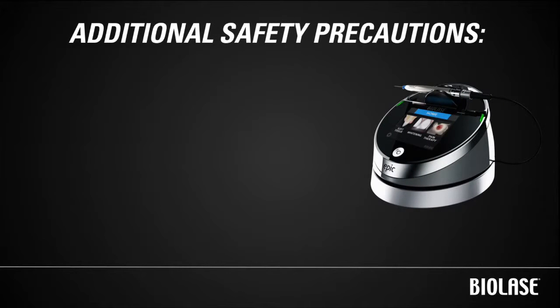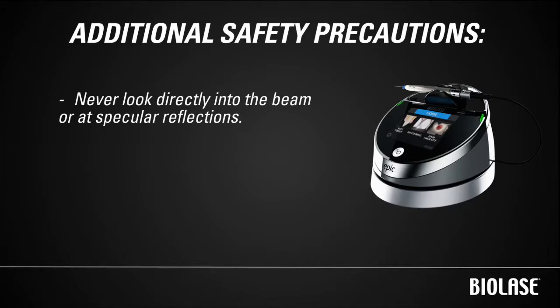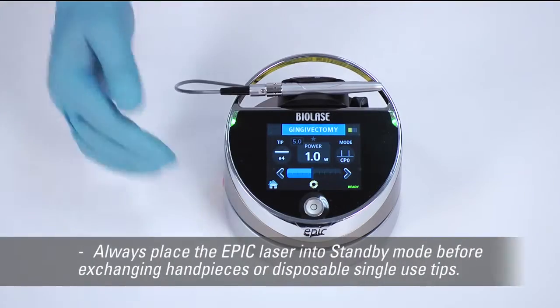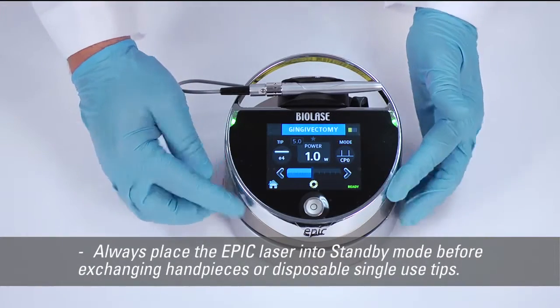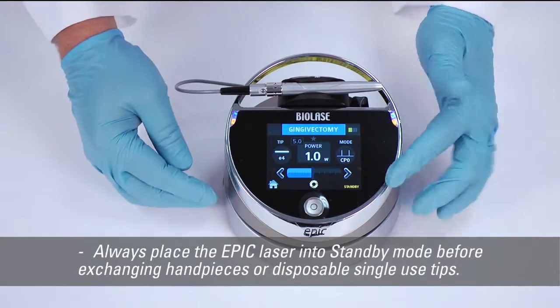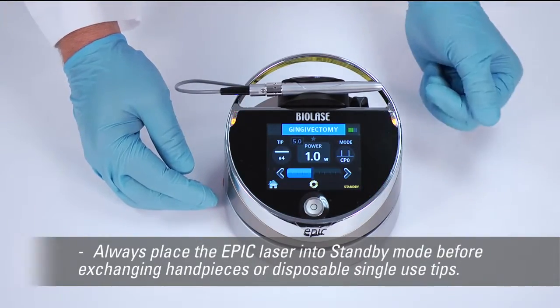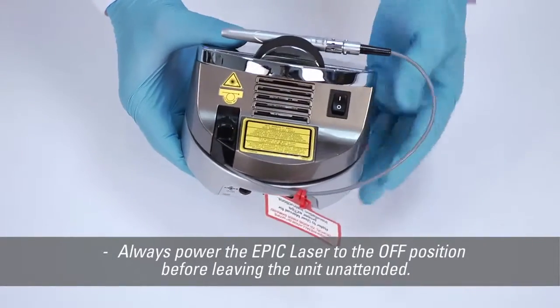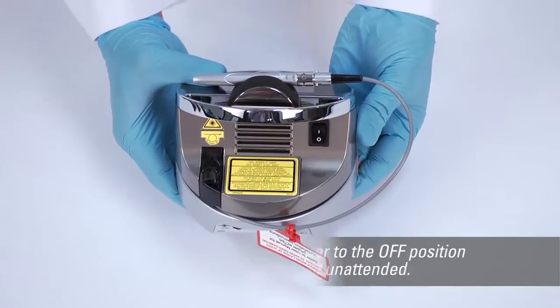There are several additional safety precautions to be aware of. Never look directly into the beam or at specular reflections. Never direct or point the beam at a person's eyes. Always place the EPIC laser into standby mode before exchanging handpieces or disposable single-use tips. Always power the EPIC laser to the off position before leaving the unit unattended.